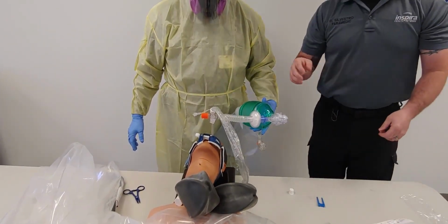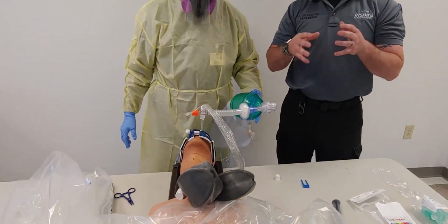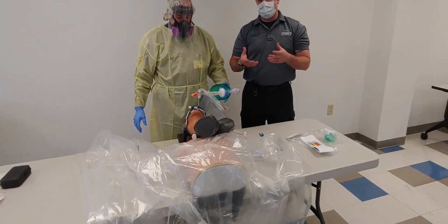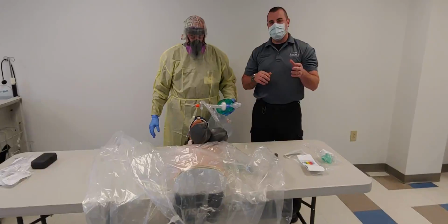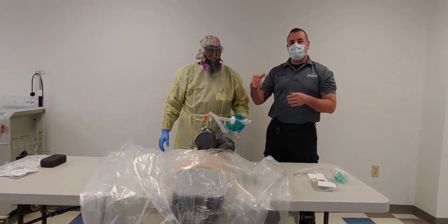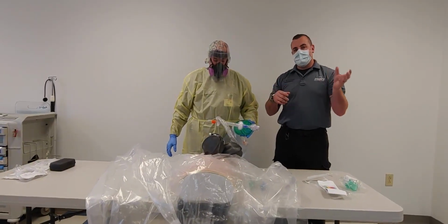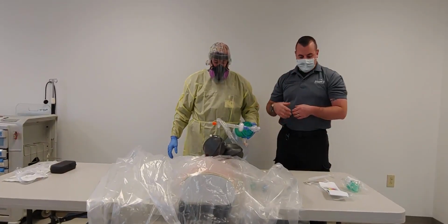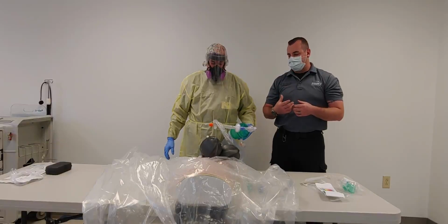Okay. Now for our SCT people in hospital, our new policy is, if you have someone on a vent circuit in the hospital, hopefully this system's probably already there. And then what you're going to do is you would use the Dravon clamps in between their system and yours. So you use the clamp, you clamp it off, make sure it's on one of the inspiration breaths that they're going to give. Then attach our Revel, take the clamp off, and allow it to continue to breathe. It's just an extra step that we want to do to help minimize exposure for our employees.